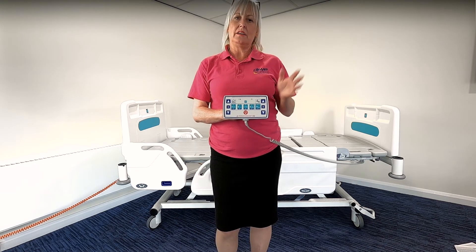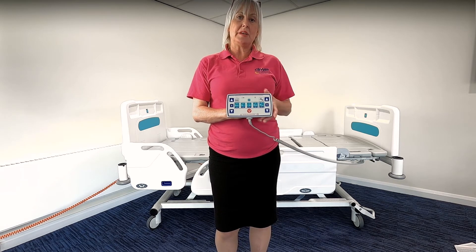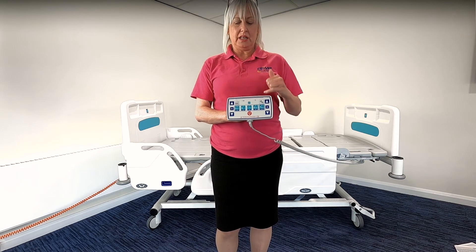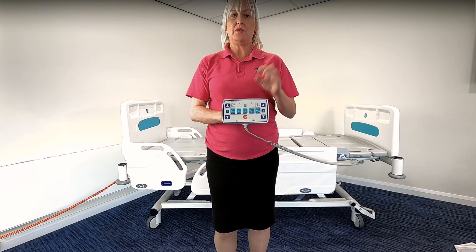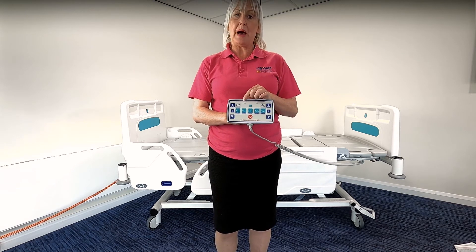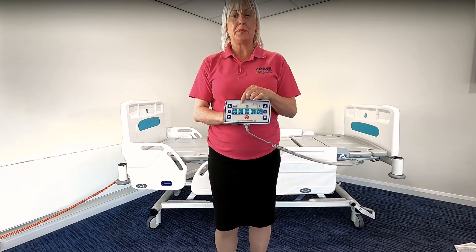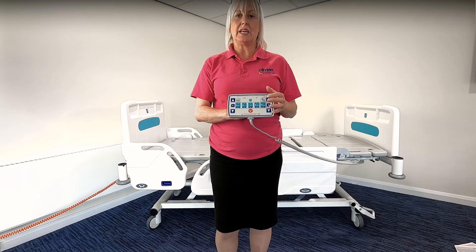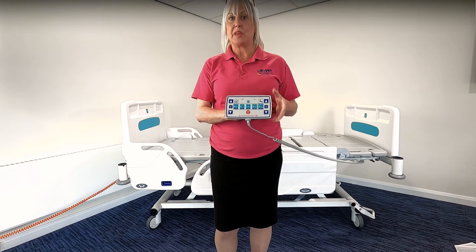The nurse control handset controls all the functions of the Innovate IQ bed and it is designed to be kept on the footboard when not in use. The handset clearly identifies what power source is powering the bed. An amber light will be lit if you are connected to the main supply indicating it's been powered, or if it's been powered by battery then the battery light will illuminate amber. In addition, if you are using battery power for some time, when you utilise the handset an audible alarm will sound informing you that the battery power is becoming low.